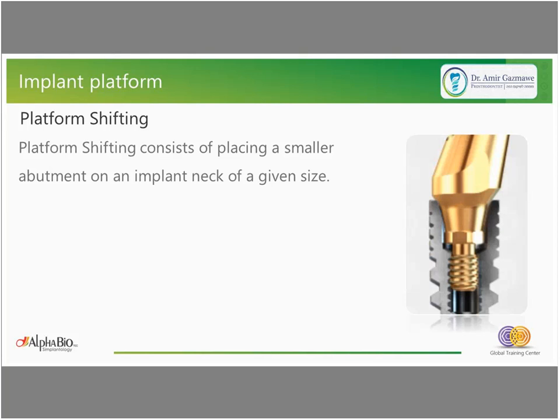That's the way that we can also achieve vertical biological width that can isolate the soft and hard tissues from the mechanical forces that can be applied on the restoration and finally to the implant. So this is supposed to be a good solution in order to stabilize the soft tissue and to avoid excessive resorption of the bone.